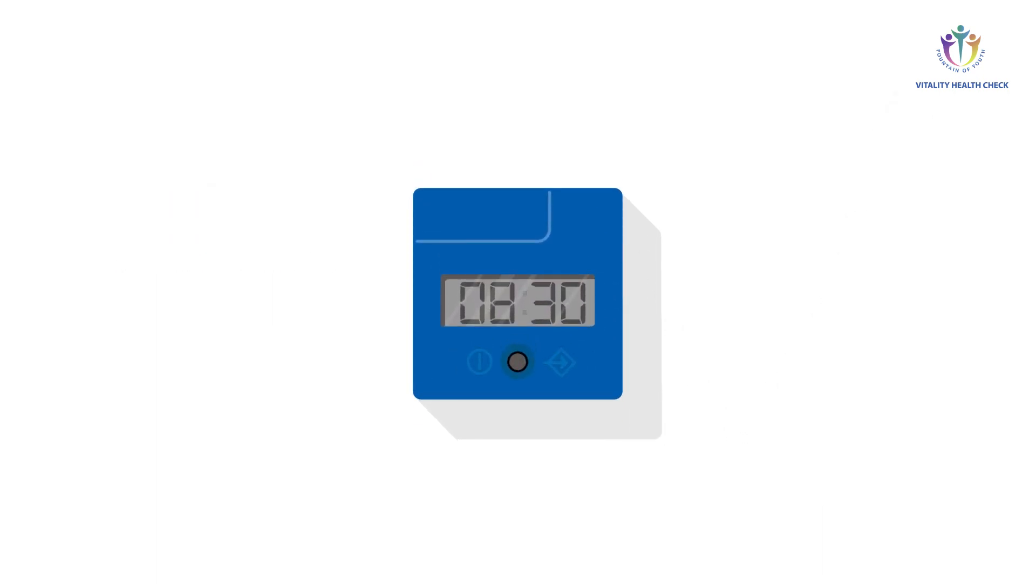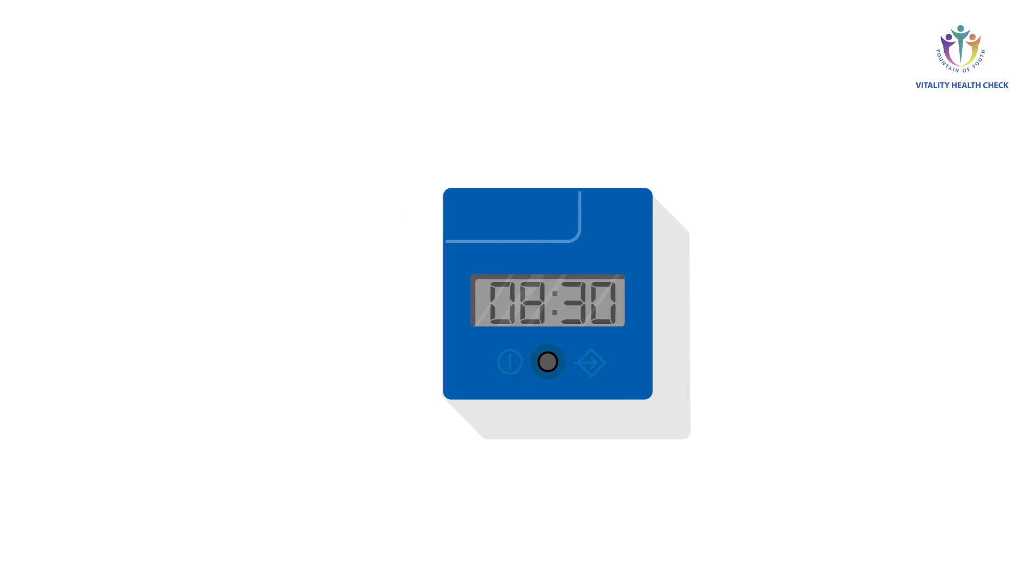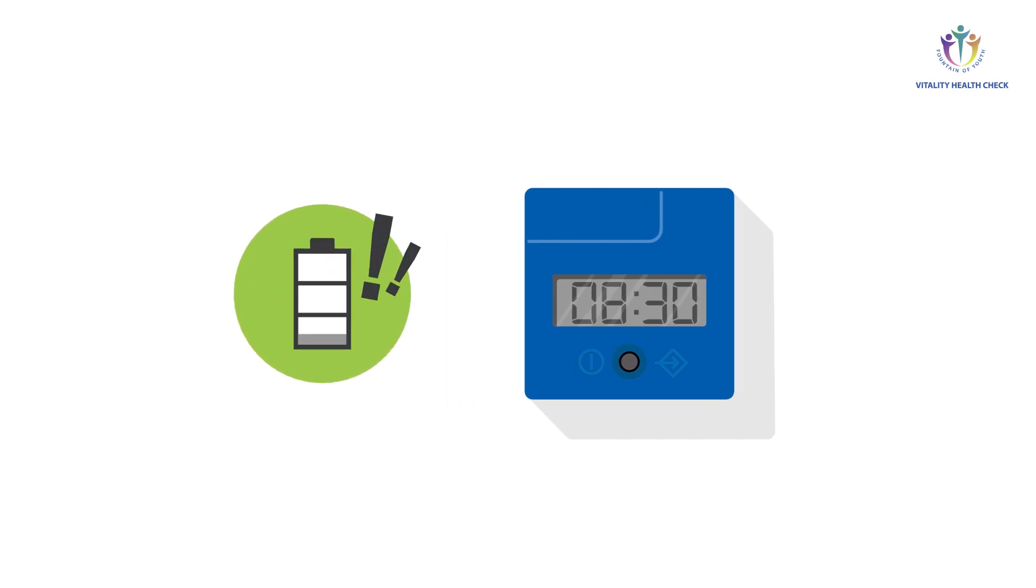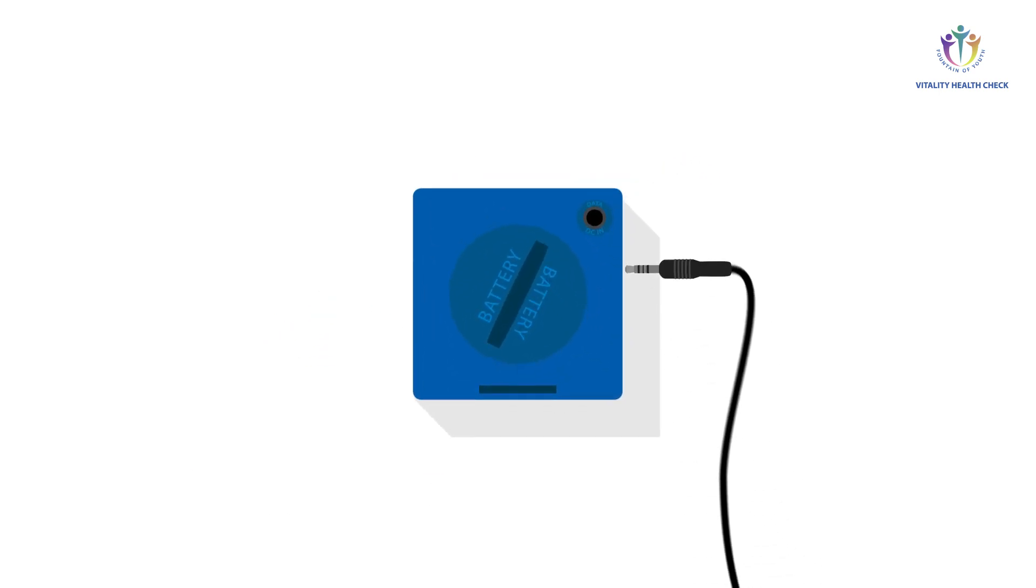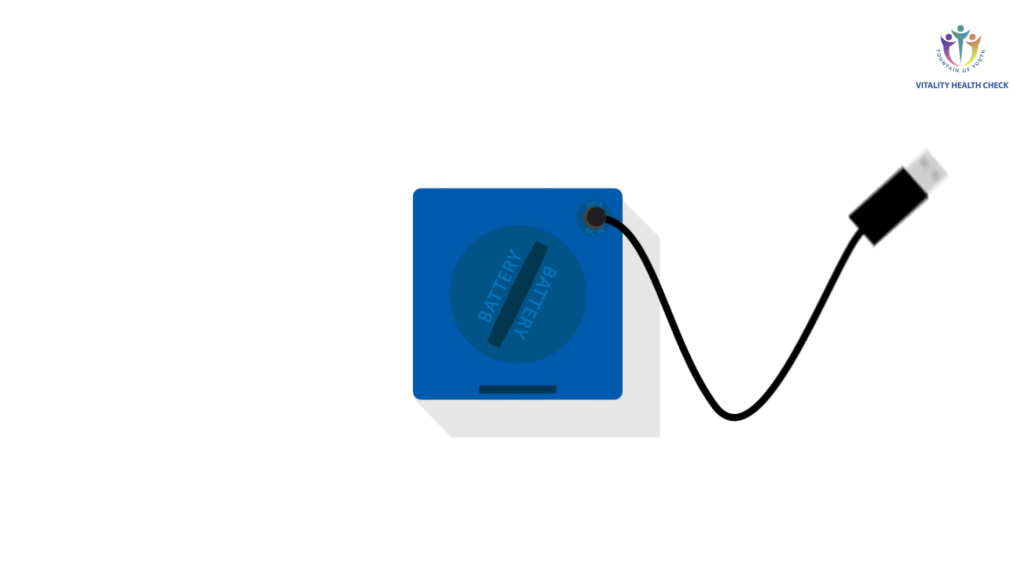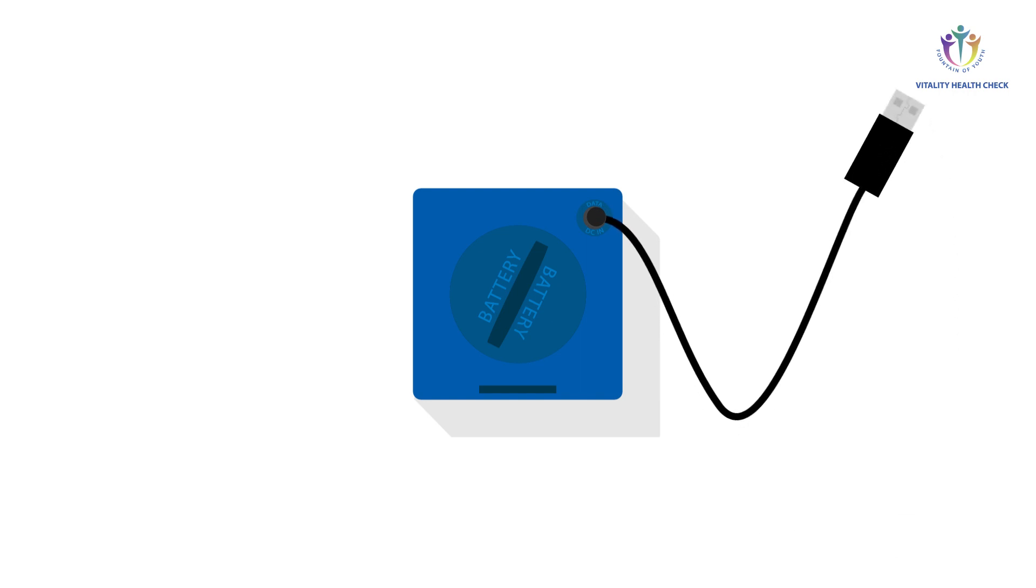If you frequently run the VHC reader in timer mode, it might happen that you don't notice the battery warning symbol showing up during countdown because you come back only after the countdown is finished to read the quantification results. Thus, in case you frequently use the timer mode, it is recommended to ensure permanent power supply via the data reader cable.